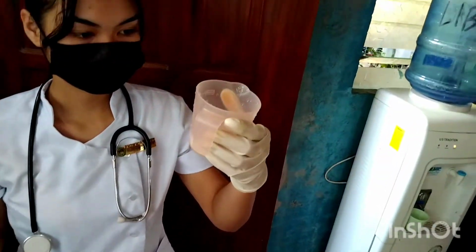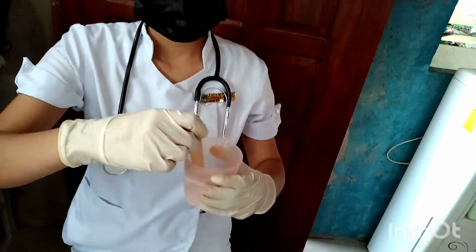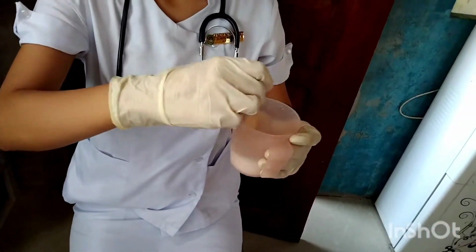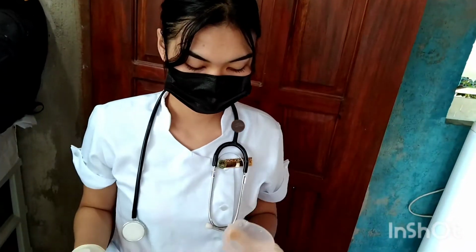Next is to prepare feeding container to administer formula. Have tube feeding at room temperature because cold formula may cause gastric cramping and discomfort because the liquid is not warmed by mouth and esophagus.